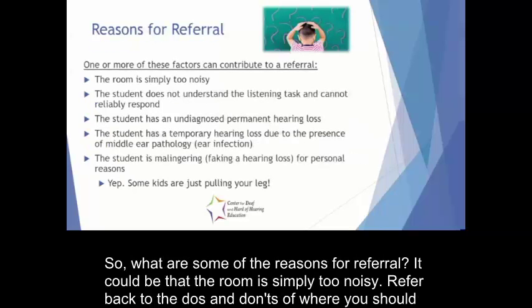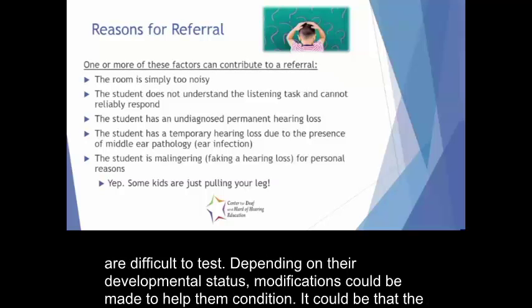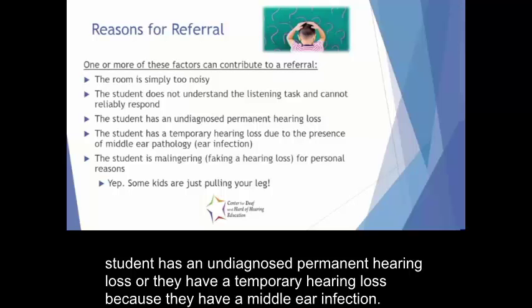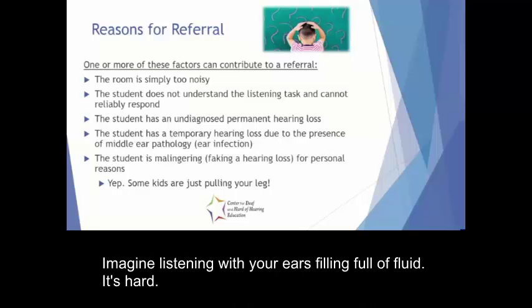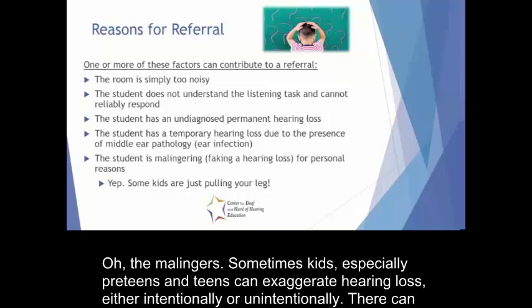So what are some of the reasons for referral? It could be that the room is simply too noisy. Refer back to the do's and don'ts of where you should test. You need a room that is as quiet as possible. It could be that some students simply do not understand the listening task. Some kids are difficult to test. Depending on their developmental status, modifications can be made to help them condition. It could be that the student has an undiagnosed permanent hearing loss, or they have a temporary hearing loss because they have a middle ear infection. Imagine listening with your ears feeling full of fluid. It's hard. It could also mean that the student is malingering, or faking a hearing loss for personal reasons. Oh, the malingerers.